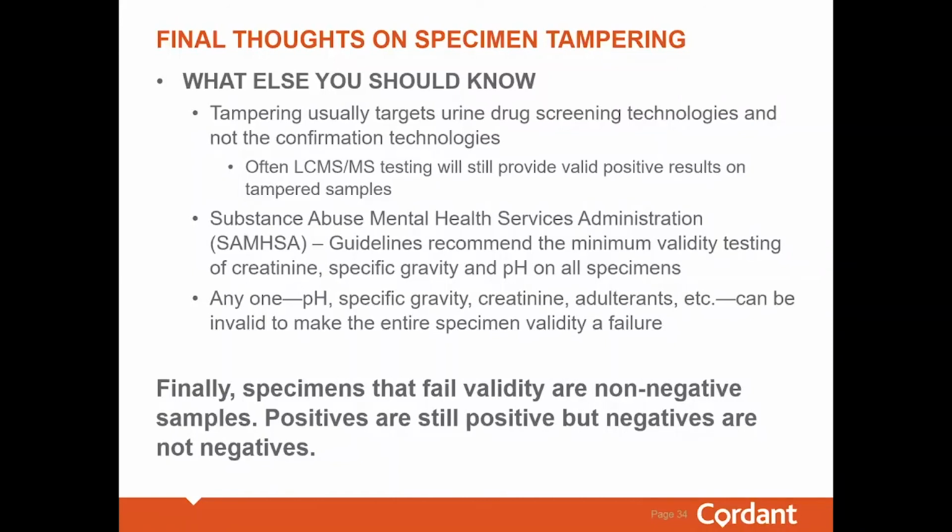Any one of these, pH, specific gravity, creatinine, adulterants, etc., can be invalid to make the entire specimen validity a failure. Finally, specimens that fail validity should be considered non-negative samples. Positives are still positive, but negatives are not negatives.